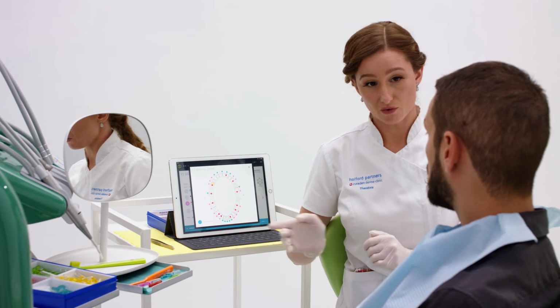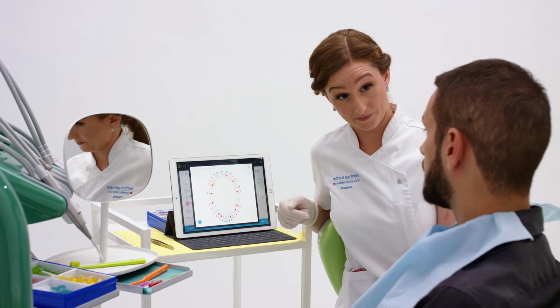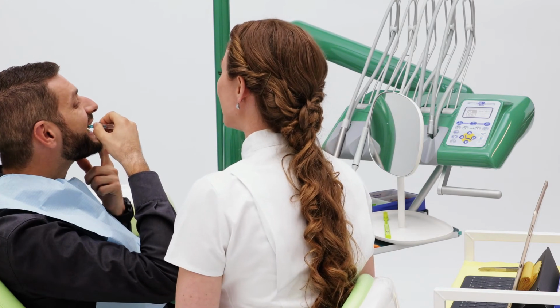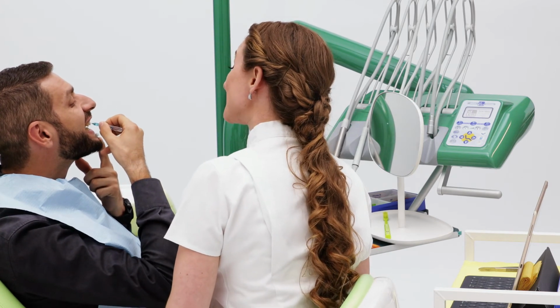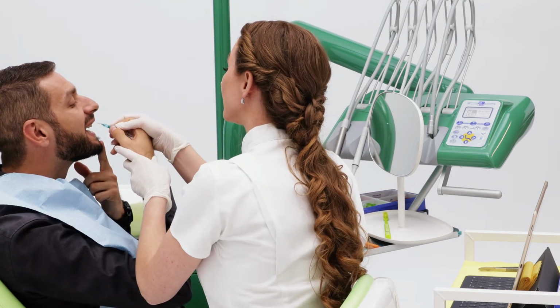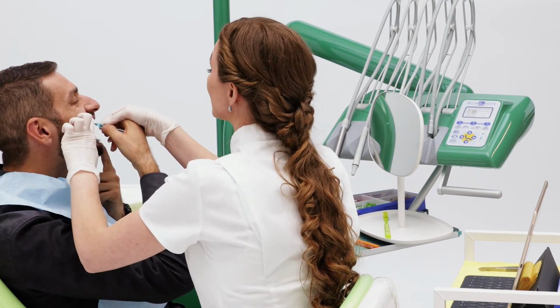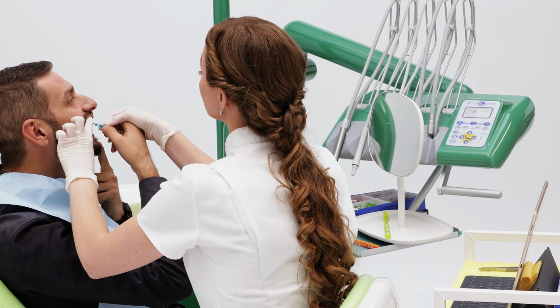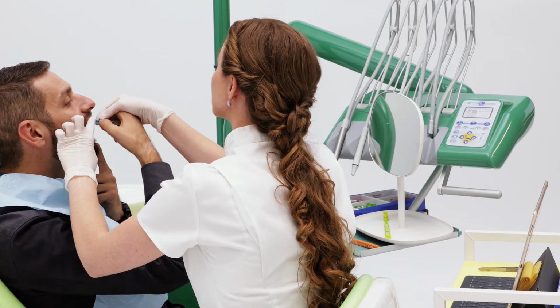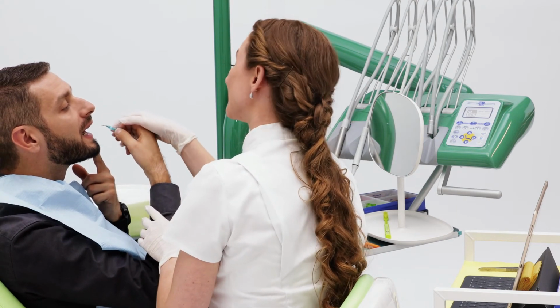I begin the dental coaching with my patient by suggesting we begin with the smallest interdental brush and in an area that will feel easy for the patient when starting. In Edward's case, I have suggested the turquoise prime interdental brush to be used on the upper anterior teeth. The reason why this routine is suggested is to help build upon the feeling of ease and success when using the interdental brush. This also gives the patient confidence when it comes to using the interdental brush later on at home. I continue assisting and teaching Edward the technique by using touch to teach methods.